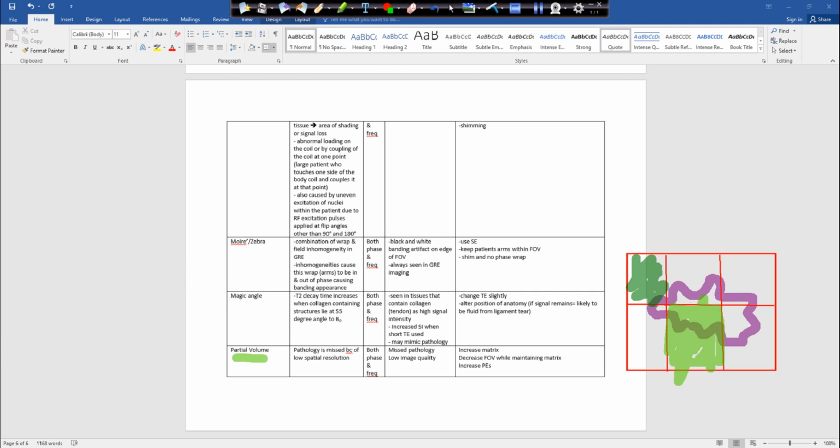So how do you know that you're missing something? Sometimes, if it's so small, hopefully it's not a pathology that's going to be affecting much. And pathologies grow over time, right? So take that small metastatic lesion in the brain. Say you have breast cancer, and people with breast cancer sometimes get brain MRIs on a yearly basis to see if it's metastasized.